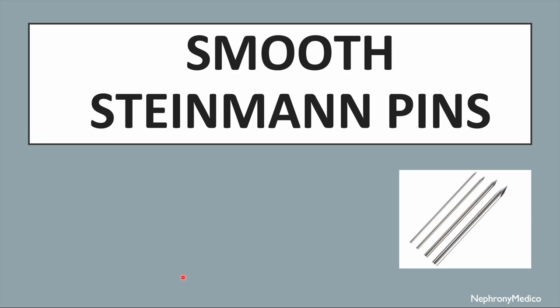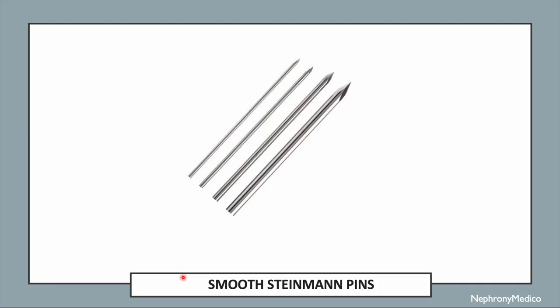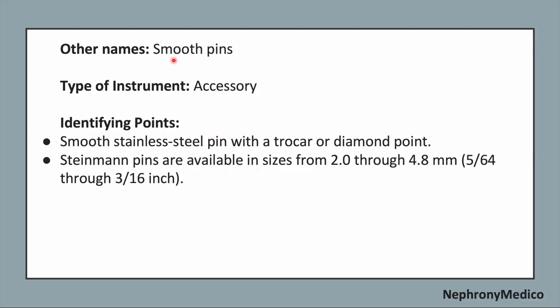Let's talk about Smooth Steinmann Pins. This is a picture showing Smooth Steinmann Pins. Then the name is Smooth Pins. It is an accessory type of instrument.